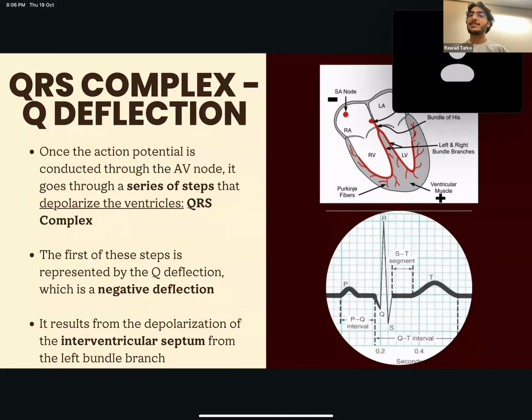Okay, next, your QRS complex, and specifically, we're going to be talking about the Q deflection. Now, this is actually, I don't know why, to be honest, maybe it's just me being weird, my favorite part of the ECG. It's just such an interesting concept. And every single time I study it, it's so interesting.